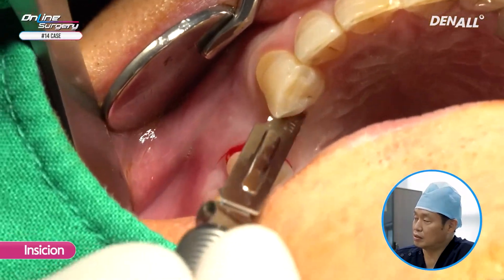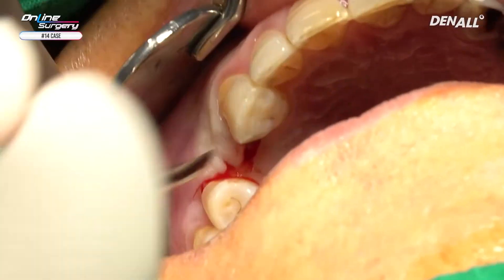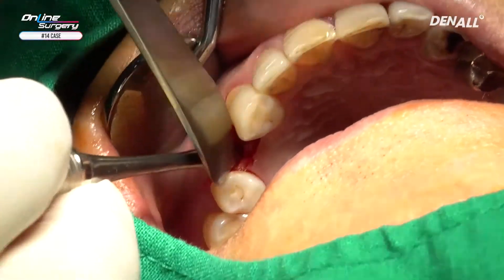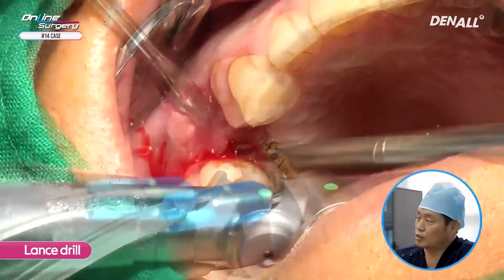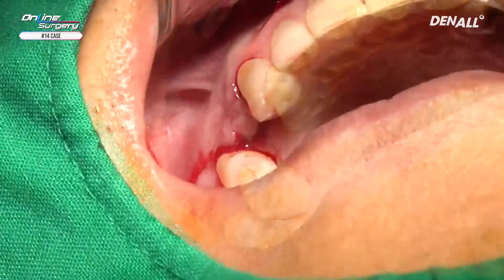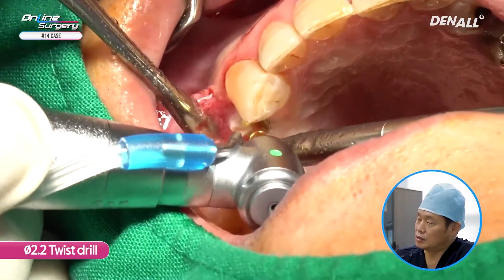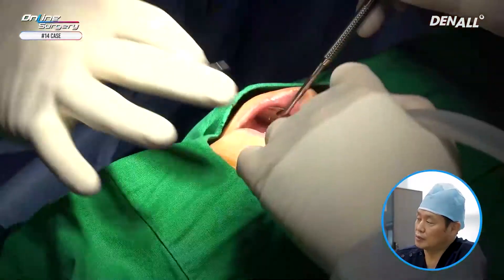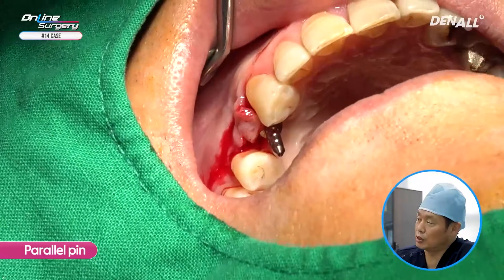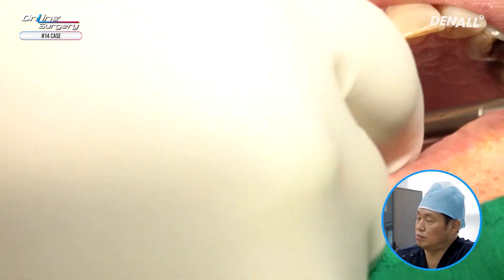A crestal incision is made slightly palatally. In order to get the drill hole position, I am using a lance drill. A 2.2 twisted drill is used and drilling is done up until 10 mm. A parallel pin is placed to check the path with the antagonist. The implant has been placed slightly palatally because it's an upper premolar and it is facing the buccal cusp — the functional cusp — of the lower molar.